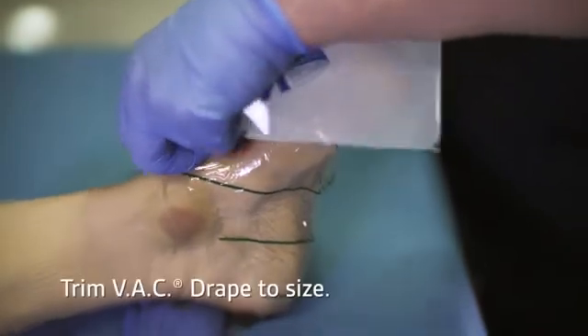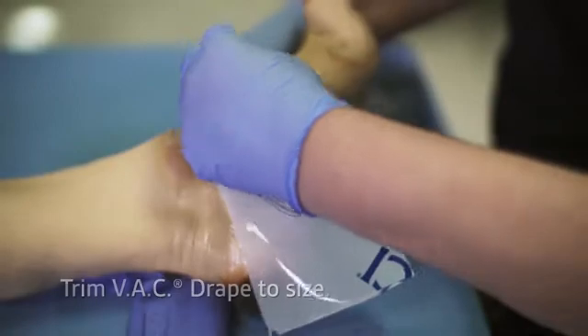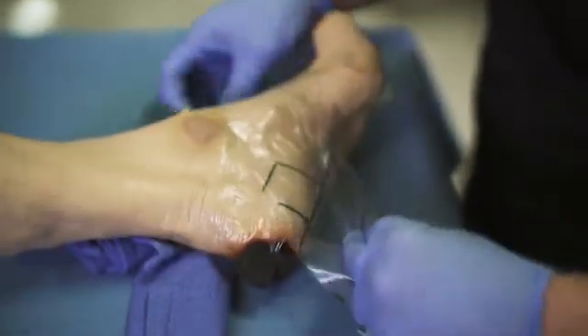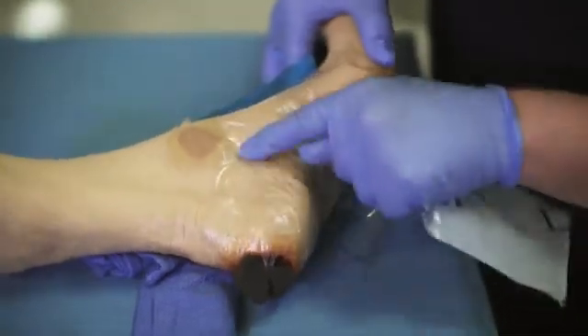Peel back one side of layer one and place it adhesive side down over the intact skin. Then remove the remaining side of layer one, the green striped stabilization layer two, and the perforated blue handling tabs.